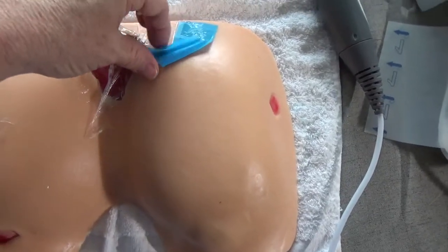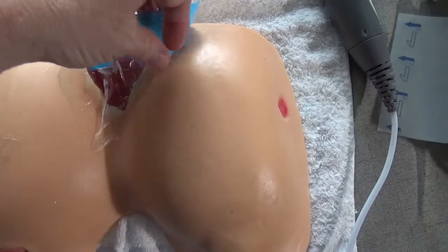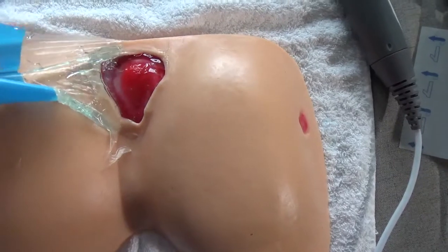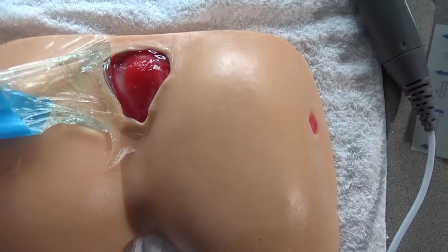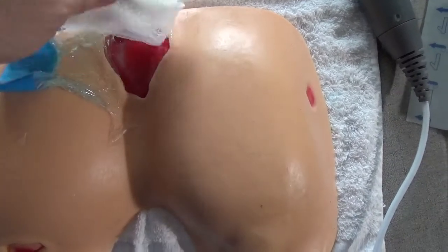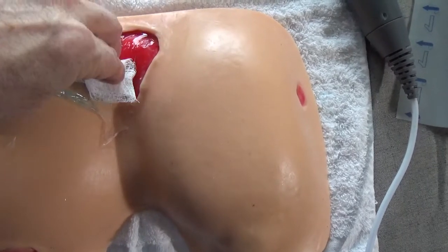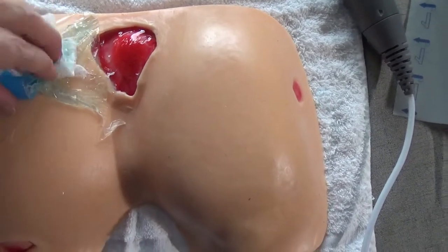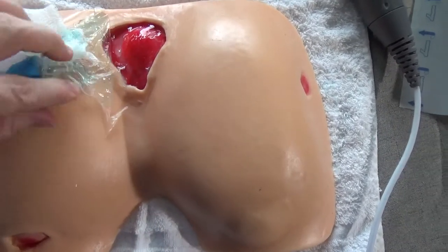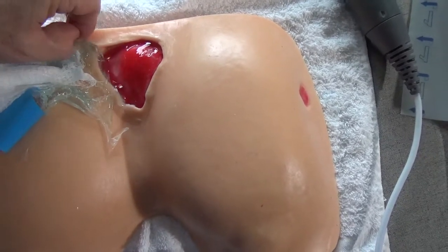So once the dressing is removed, then you have sterile hydrogel in the wound, and you can irrigate that out if you don't want it in there, or you can use your sterile gauze to help cleanse the area. It depends on the patient's pain control at that point. You can cleanse the area and then dress the wound with whatever dressing is on the patient's wound care protocol.